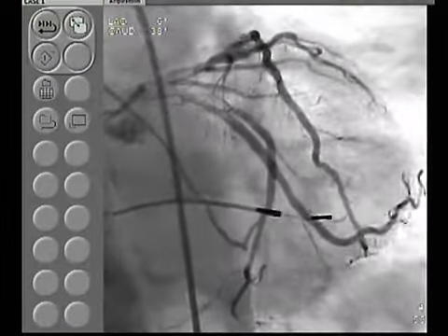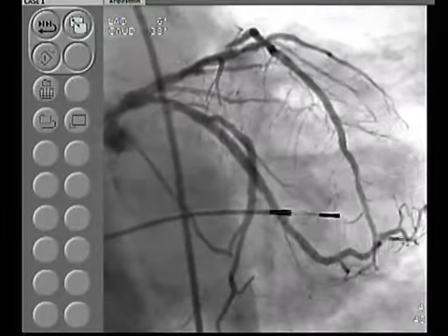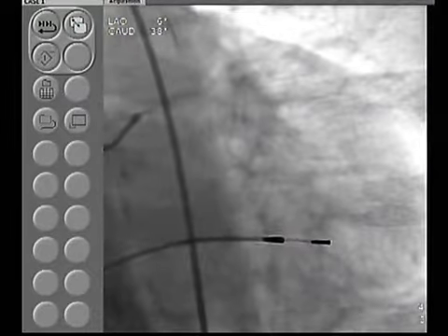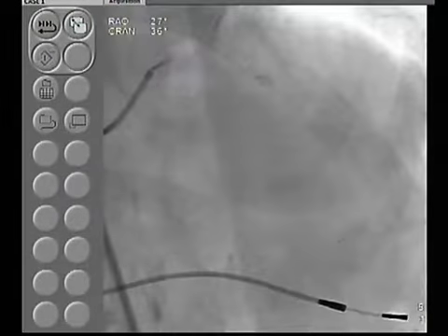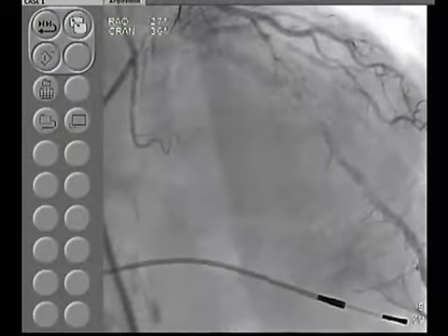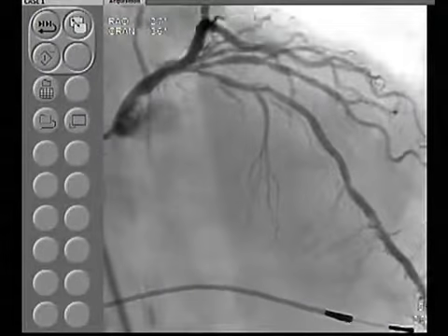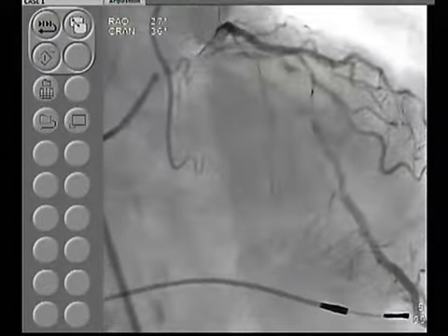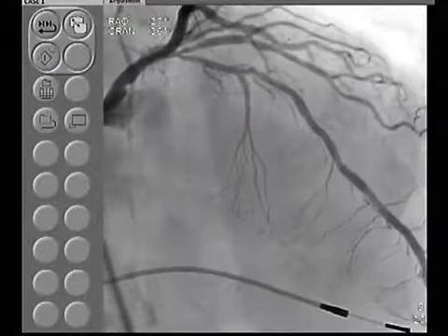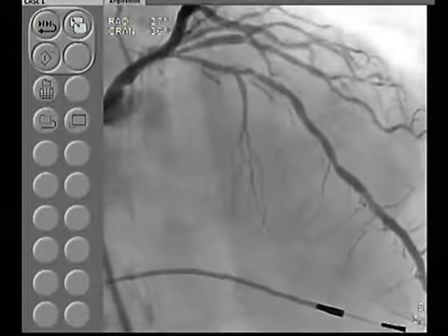And here the left main is non-obstructive, and our circ stent that was done last time looks angiographically normal, and the proximal LAD is okay on that view. But here, if you see, there is 80% disease involving a large diagonal, so it's a bifurcation. The calcific LAD lesion is actually extending into the mid LAD, with moderate disease in the distal LAD, but it's a large size vessel.